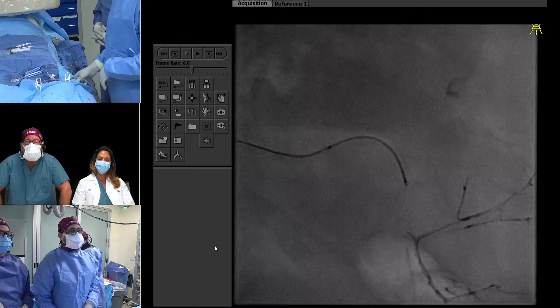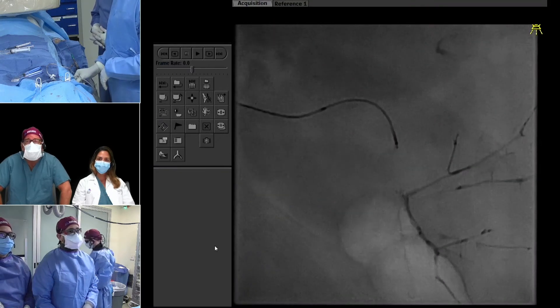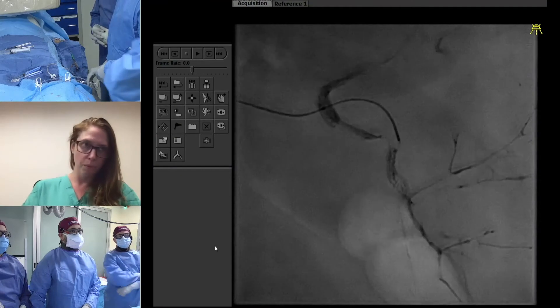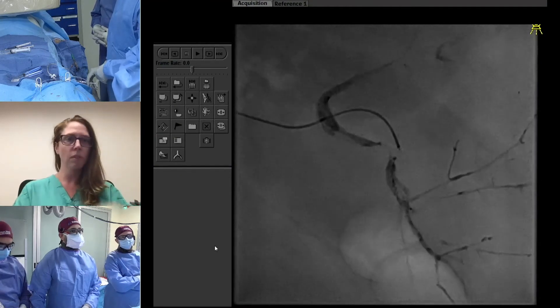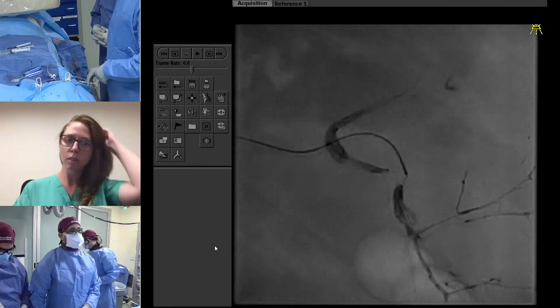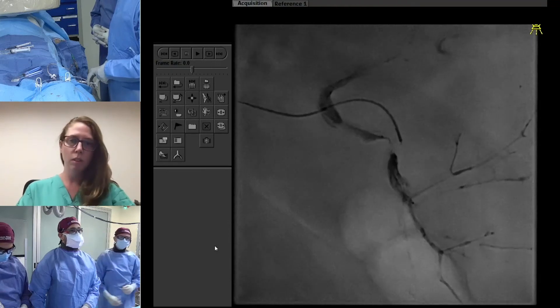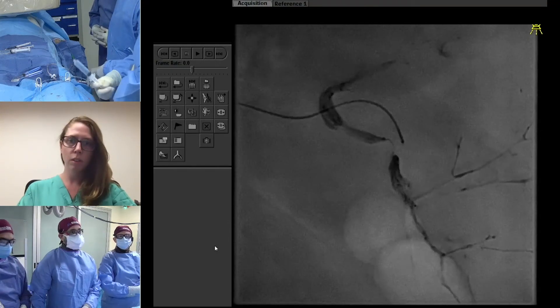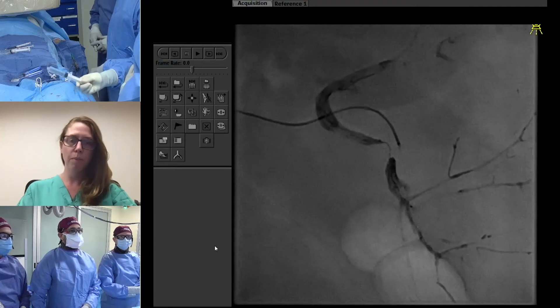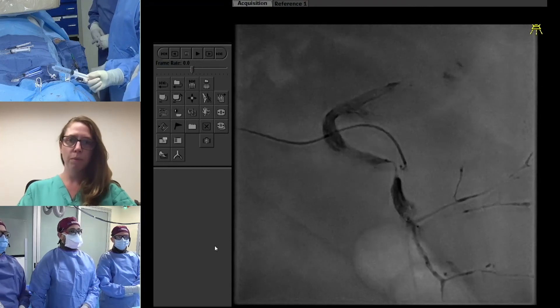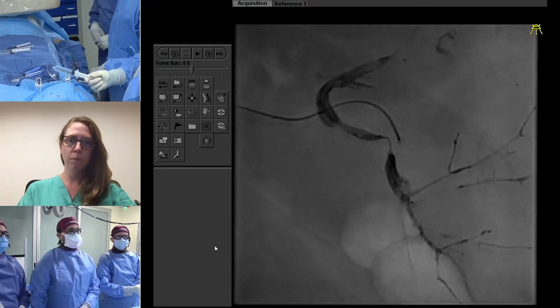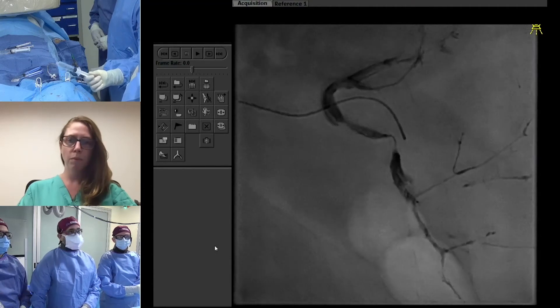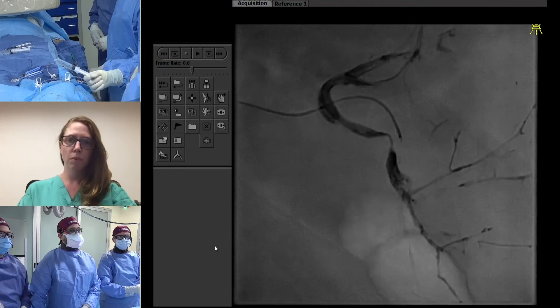I think we need to push more. I agree — I would do a little more here. We did it with a guide as opposed to just a straight diagnostic catheter, so I'm not as worried about getting something stuck on the tip. We would make sure there's nothing in the catheter, do it under aspiration, maybe even send a Benson wire down.